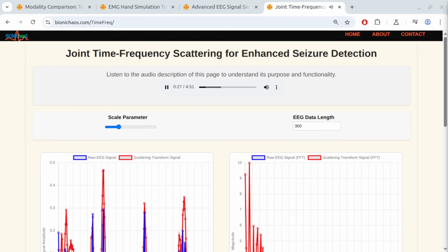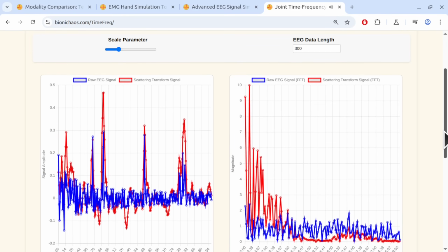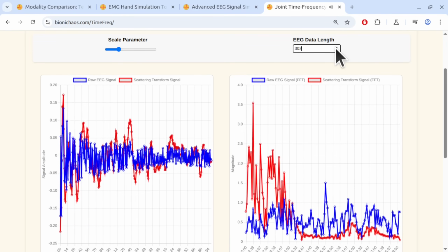Exactly. And that non-stationary nature is precisely why a lot of standard analysis methods kind of fall short. They might just miss those really subtle quick spikes or the specific ways the background brain rhythms shift during a seizure. Like trying to get a whole song just from one beat. Yeah, or just one instrument's part. You really need the whole picture, how it all unfolds over time.